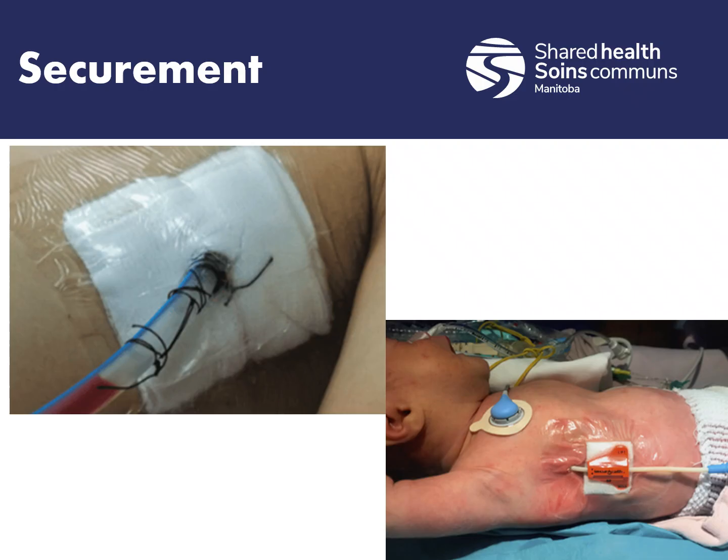As you can see here, a lot of times these chest tubes will be secured with what they call a purse string suture to minimize the risk of dislodgement. Usually there's suture in place, and they'll put a dressing over top. An occlusive airtight dressing should be applied over the insertion site, and then it's reinforced with tape to ensure a complete seal. If we're taking over care of these patients or transporting them, we need to take a look at this before we leave the facility to make sure that the dressing's secure, the tube is secure, it's sutured properly, the sutures aren't loose, there's no drainage or leaking from the site, and that the tube is not kinked or dislodged.